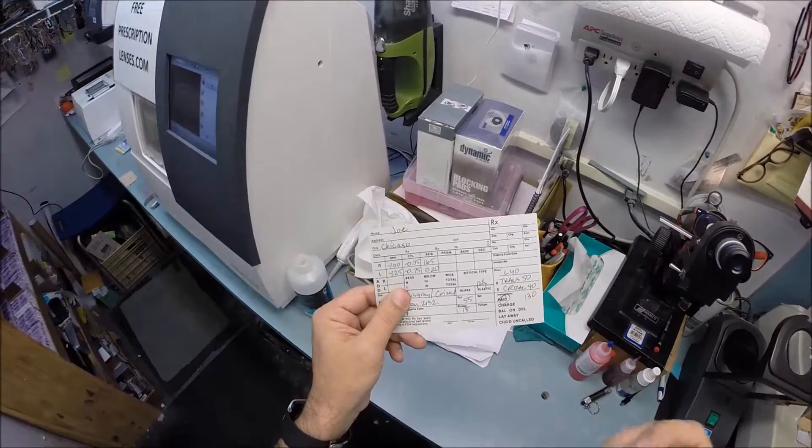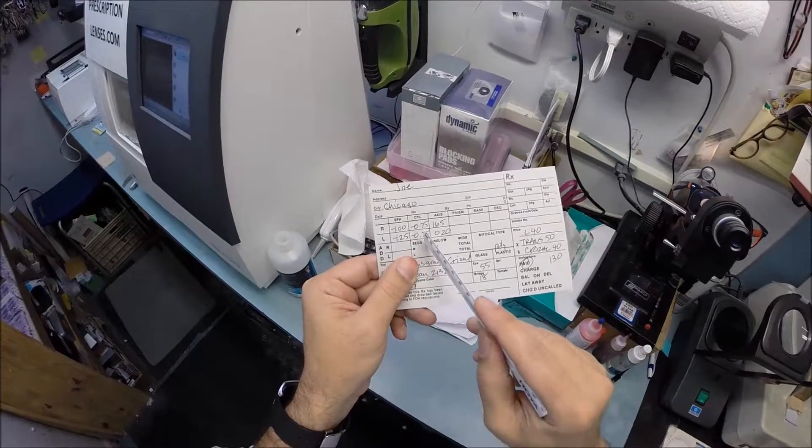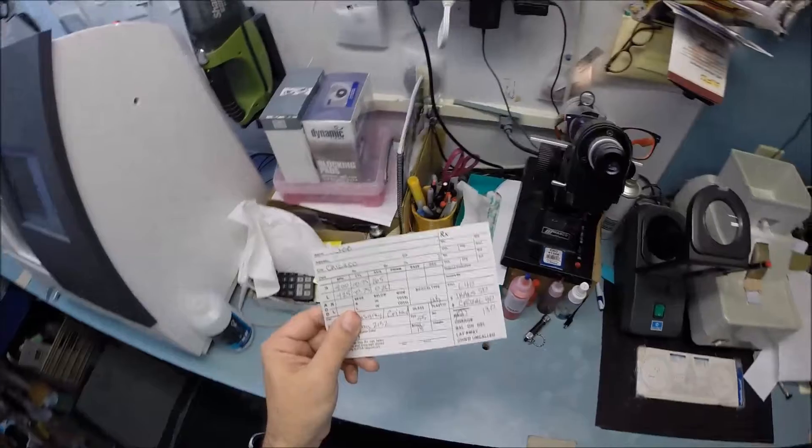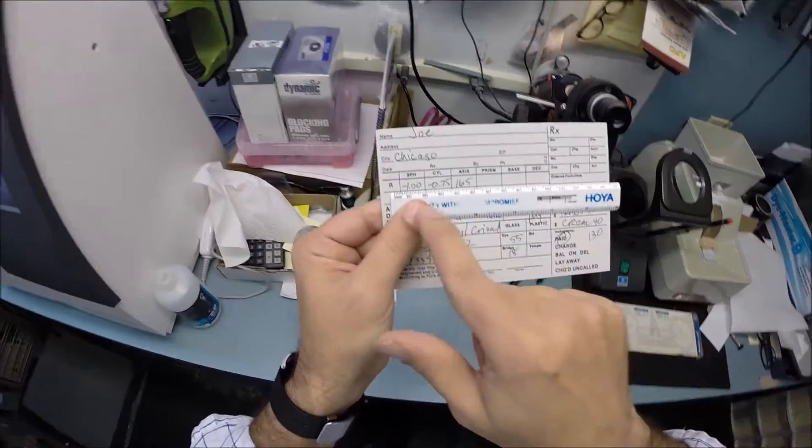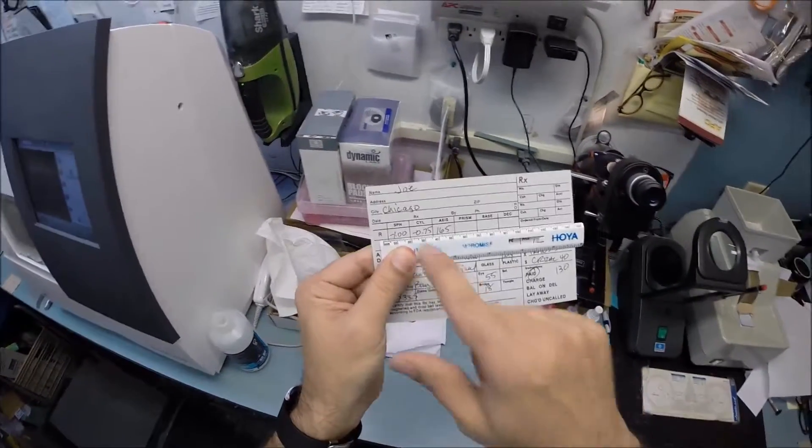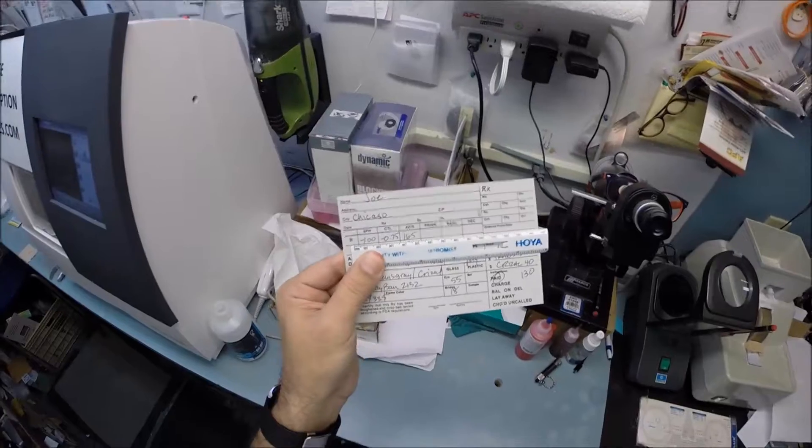The unit of measurement we use in the optical world is called a diopter. It goes in quarter increments starting at zero: 0.25, 0.50, 0.75, 1, 1.25, 1.50, 1.75, 2, and so on. Without your glasses on, your right eye reads minus 1 minus 75 at 165.